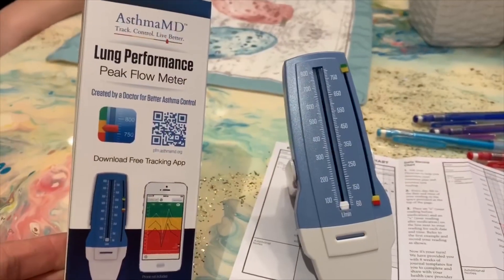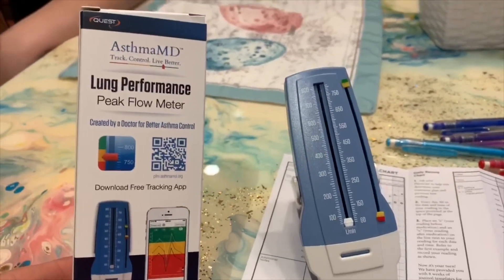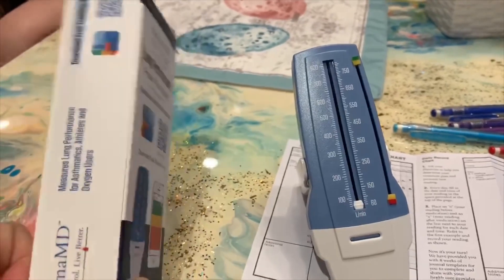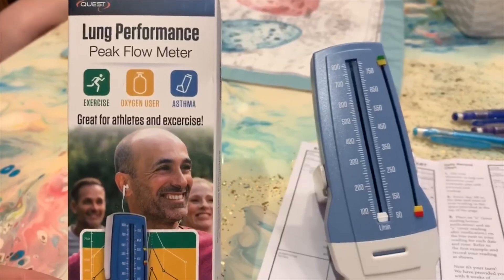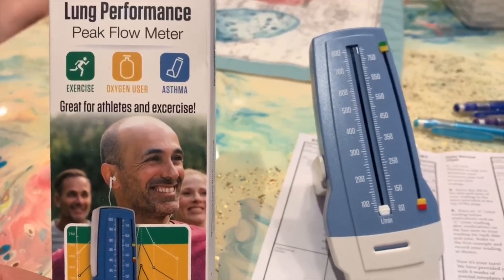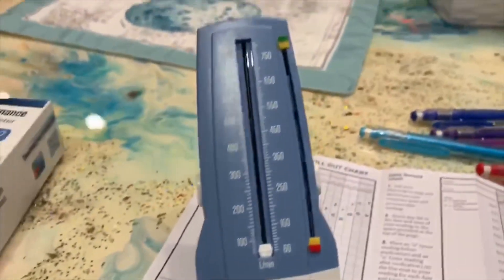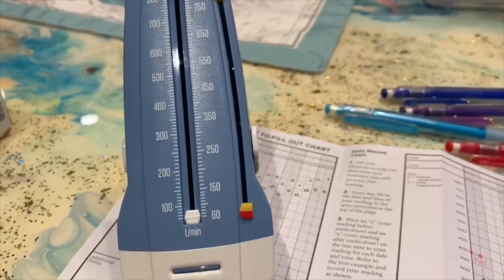Alright guys, this is a peak flow meter — a wonderful tool. You can see if your lung volume is increasing from exercise. You can also see if you are possibly headed toward illness or an asthma attack if you're asthmatic. This is an awesome tool. I used these for years as a nurse to help my patients — I worked specifically in respiratory.